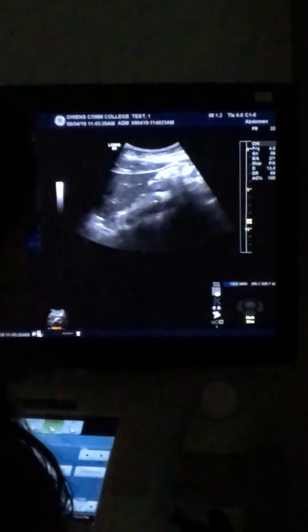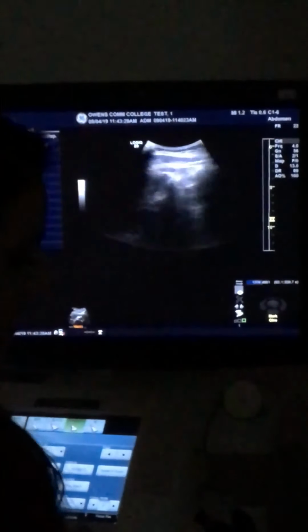So the way I do my livers is I would start with long left lobe, and then when I got here, I would just keep going this way for long right lobe. But the way your guys' is set up is you come here, and then you stop, and then you come out here. So you're doing like this, like this. So you start out here and come in and stop, and then you come out here and stop. The way some people do it is they'll do the whole long left lobe, and then they'll do the whole transverse left lobe, and then they'll do long right lobe and then transverse right lobe. So you just might see it done differently some places, and that's fine. In the end, we're all still getting the same images, okay?